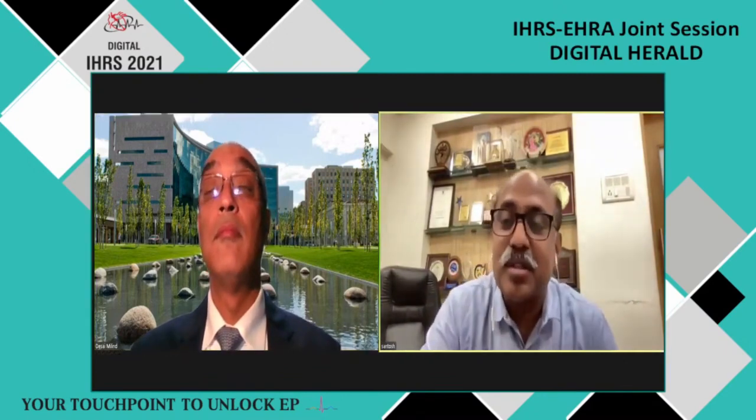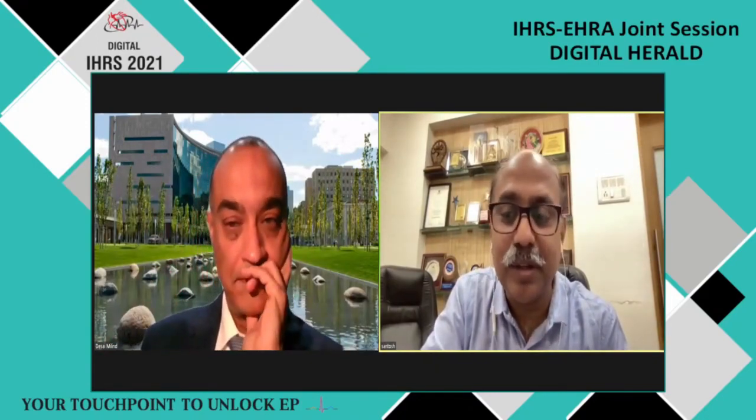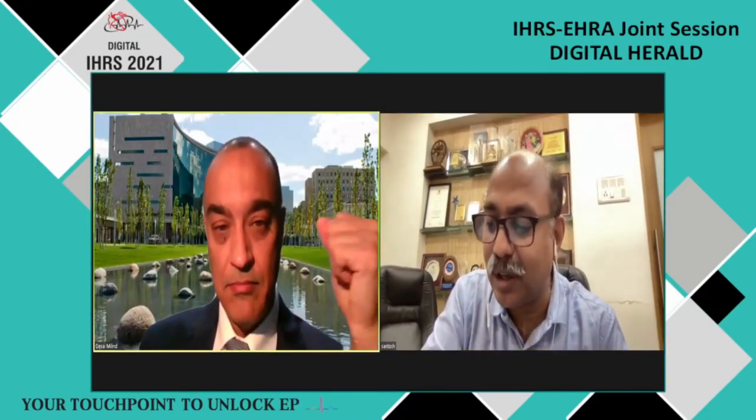Thank you very much, all the speakers. It was indeed an excellent talk. Am I audible to everybody? Yes. Hello? Yeah. It was an excellent talk by everybody. I think we had an in-depth discussion on the role of CMR in various kinds of cardiomyopathies.